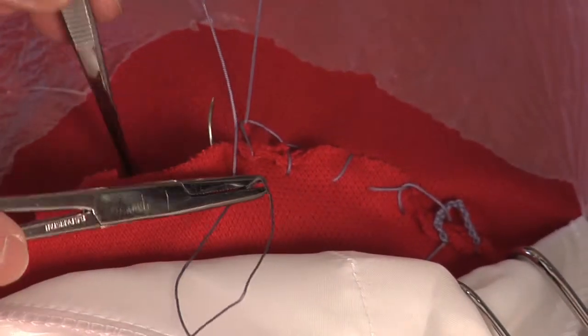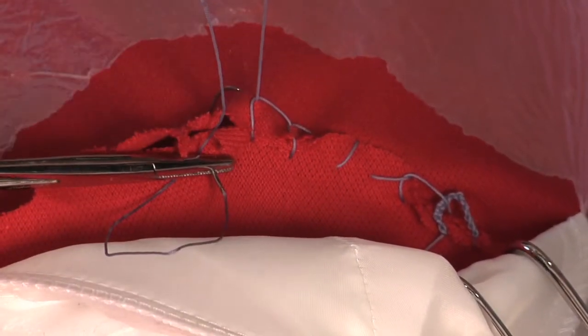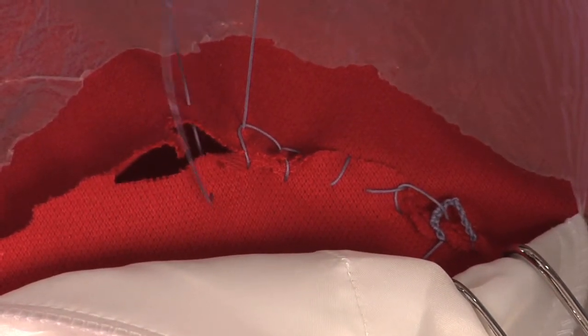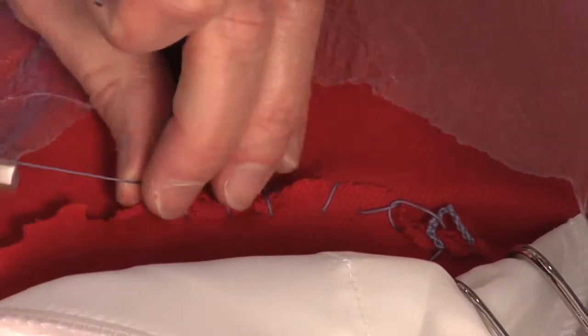In real life this needs to be pretty snug. You can't pull it too tight on the model because it gets all completely scrunched up.